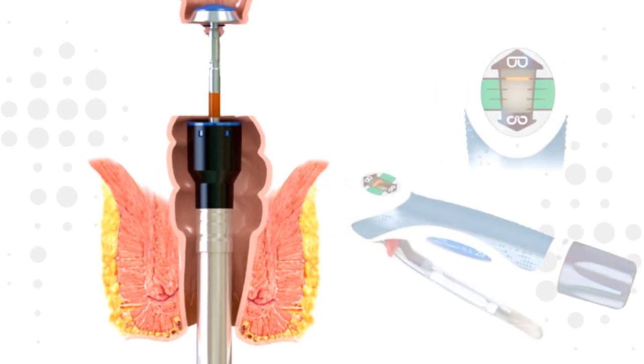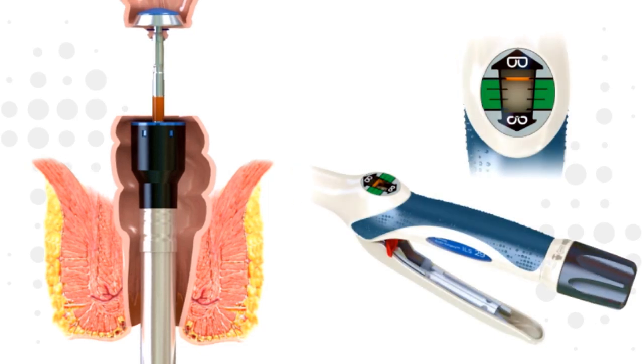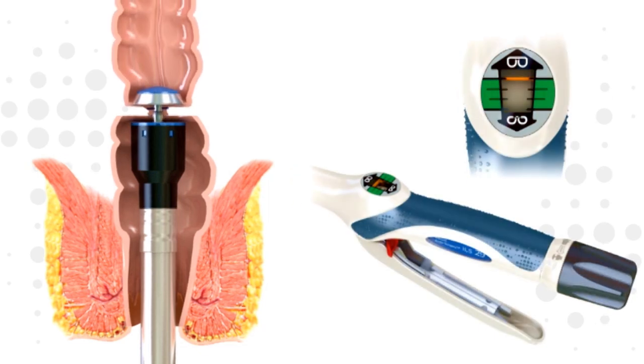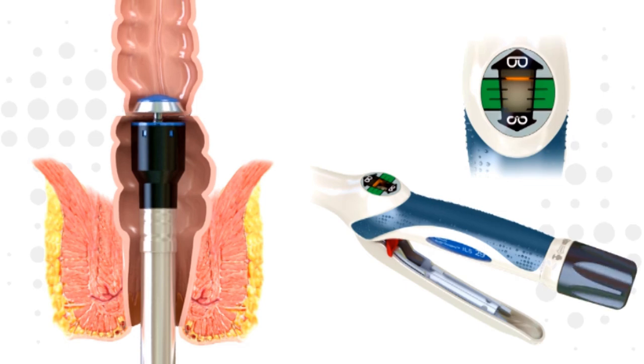Close the device by rotating the adjusting knob clockwise. As the surgeon closes the instrument, it is important to ensure the tissue remains in the proper orientation and no extraneous tissue is included. As the tissue is being compressed, the surgeon will start to feel resistance.